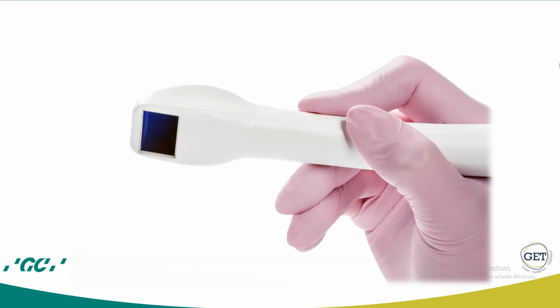The application device for scanning is an optical electronic device that captures high-resolution video images in real time during a patient scan. It is connected to the laptop via USB 2.0 high-speed cable for data transfer. The application device comprises optics and sensor electronics, which detect the real-time images, which can then be further processed in the computer.